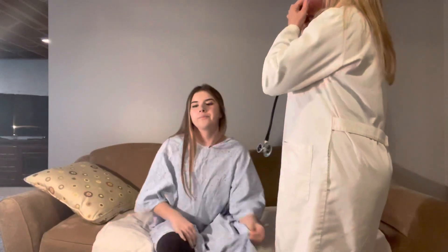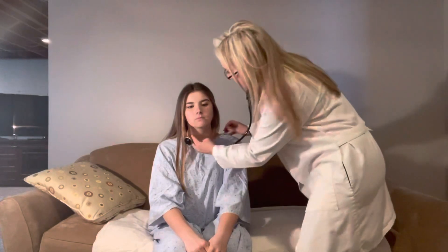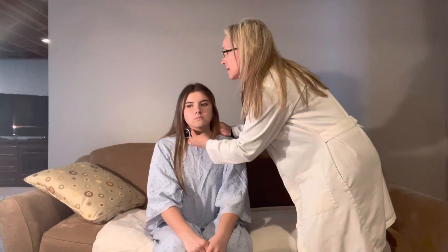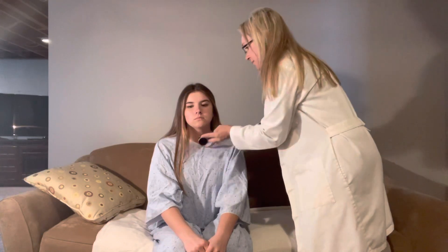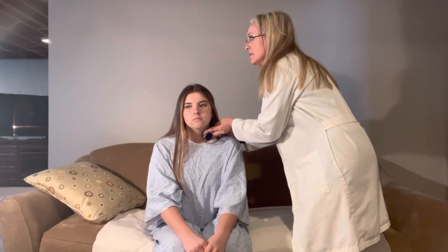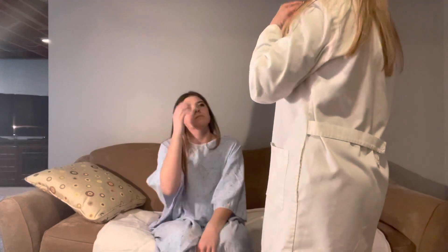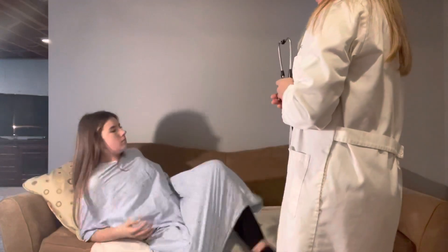Let me have you sit up for one second — I'm going to do your carotid auscultation. I'd like you to take a deep breath and hold your breath. I did not hear anything abnormal there.